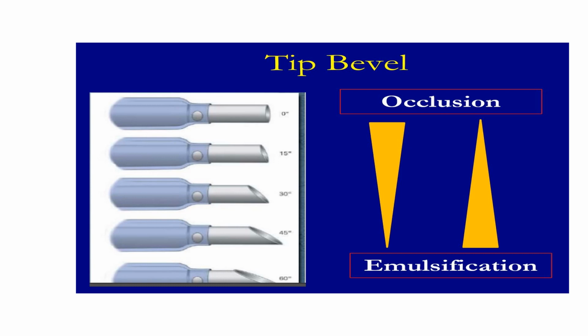The 30-degree bevel tip would be bigger, its surface area of opening of the bevel would be more than the 15-degree, and the 15-degree would be more than the 0-degree. This is important to note, as this geometrical shape is important in determining 3 things in a peristaltic pump: how fast the tip is covered by the nucleus material, that is, how fast occlusion is reached, how fast the vacuum will build once the tip is occluded, and the cutting power of the tip.